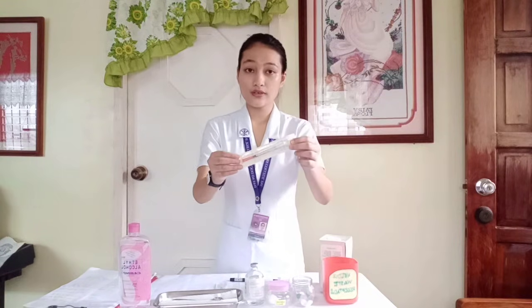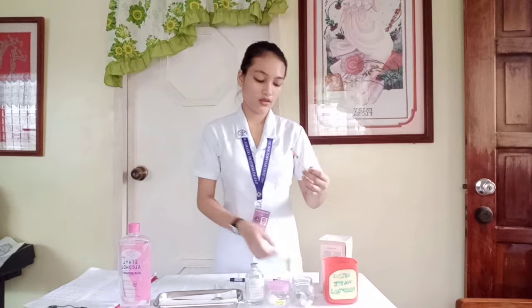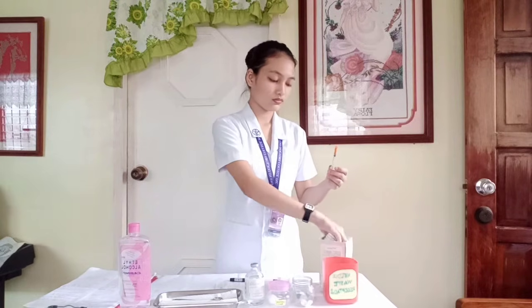Now, to prepare medication for the subcutaneous injection, we'll need to have an insulin syringe. We need to open the sterile cap, take out the syringe, uncap the syringe. Now draw air into the syringe, just like what we did with the intradermal injection, and draw air with the exact amount of the medication prescribed by the doctor.